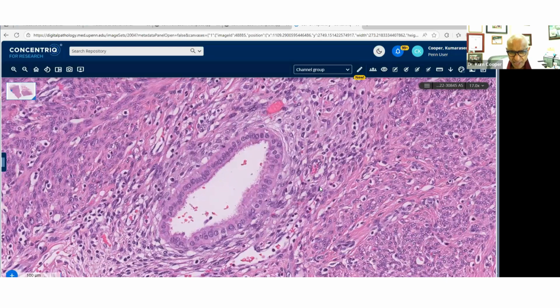There's no hemosiderin, and I don't think that the stroma really resembles endometrial stromal tumor, which brings another marker if you need to know, is this endometriosis: CD10? So that's helpful as well. So PAX8, I did not do it, but it was just based on the ER and WT1. How can we explain presence of cystic spaces? That's the endosalpingiosis, or that's the adenomyoma.